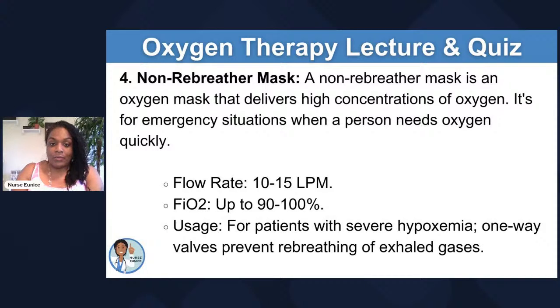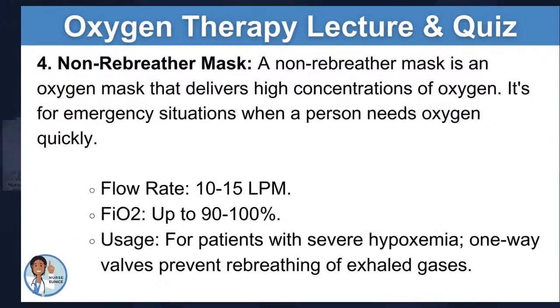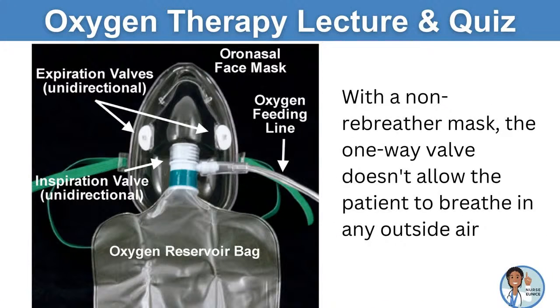You're applying the correct oxygen device and then letting the doctor know what you did once you have him or her on the phone. In most of our facilities, at no point do we wait until the doctor returns our phone call while our patient is in distress. We can go ahead and go from the nasal cannula to the next device, if we need to, to stabilize our residents' or our patient's oxygen level.